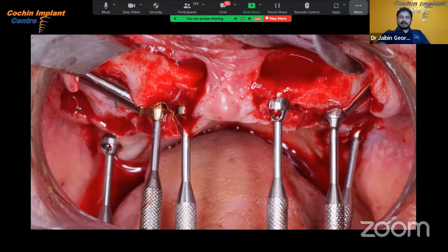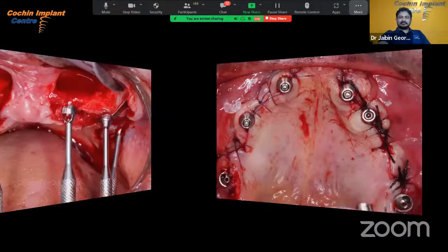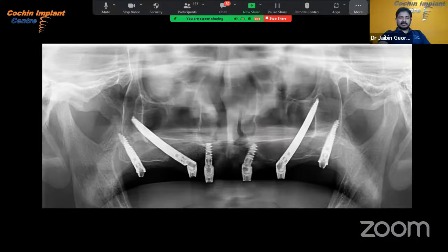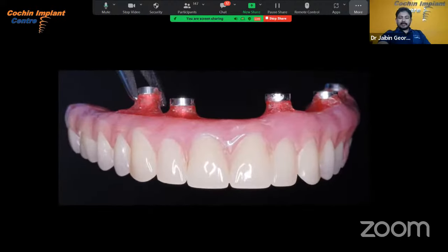So these are the multi-unit abutments with the stylus. And these are the healing abutments placed over the multi-units, and the sutures are placed. And in this case, we made an impression. Before that, we attached the conversion. We attached the titanium cylinders to the multi-unit, and we made the conversion process.